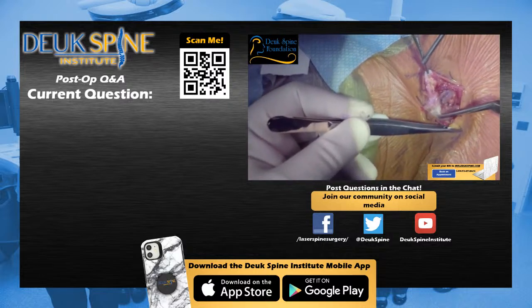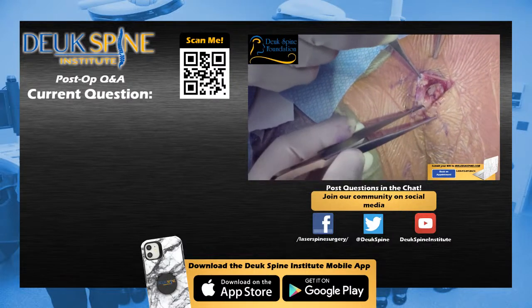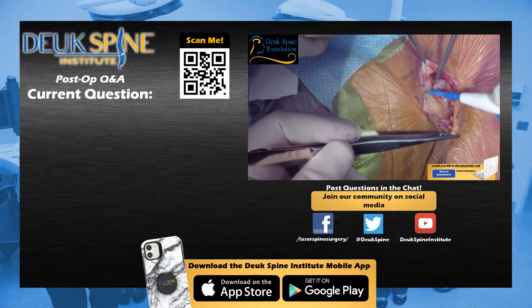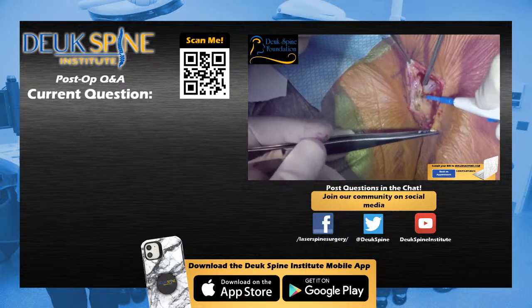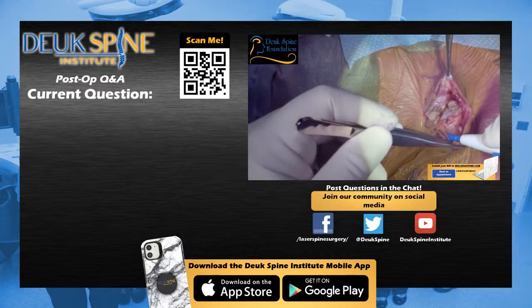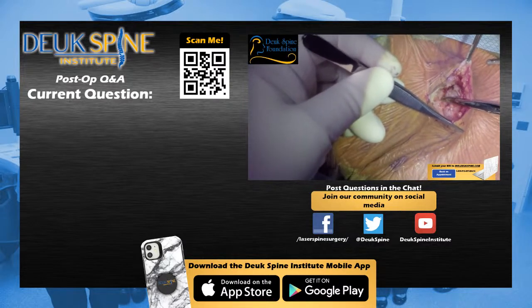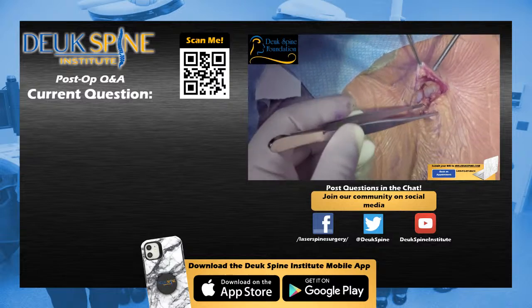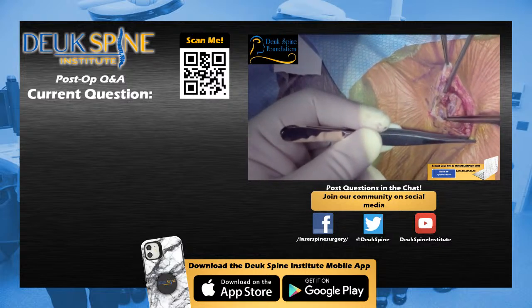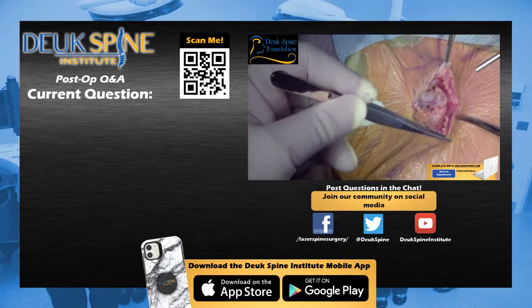And I don't remember if it was Cloward who discovered the anterior cervical approach, but I think it was Cloward who really popularized for neurosurgeons the approach going through the front of the neck. Obviously, going through the front of the neck, you saw from our exposure in the beginning of the case that you have to mobilize a lot of tissues, including the carotid artery and jugular vein, both in the carotid sheath, and we retracted that laterally, away from the patient's axis, and then retracted the trachea and esophagus medially. That was Dr. Patel retracting that most of the case. And then straight down between those structures is the spine itself, which you saw.